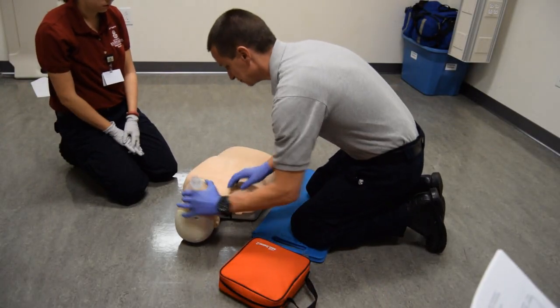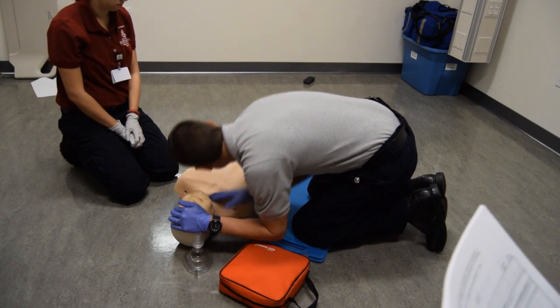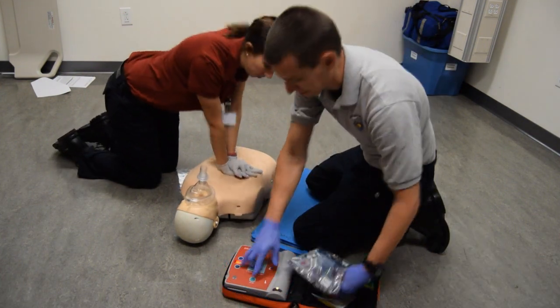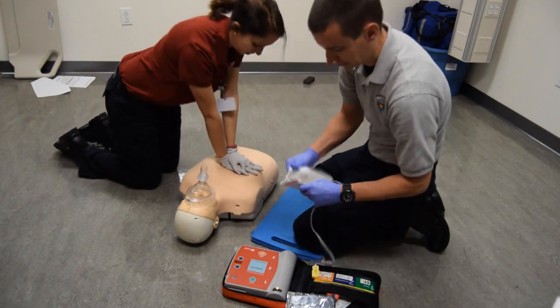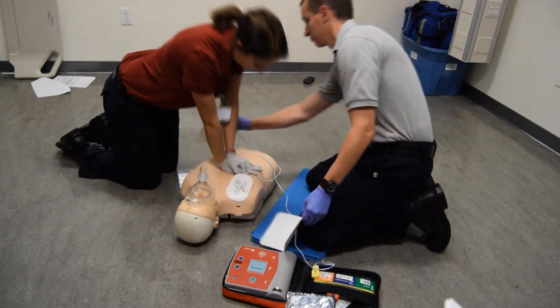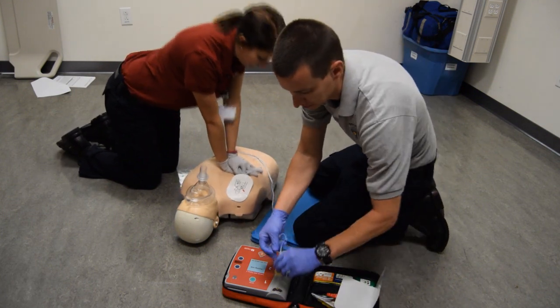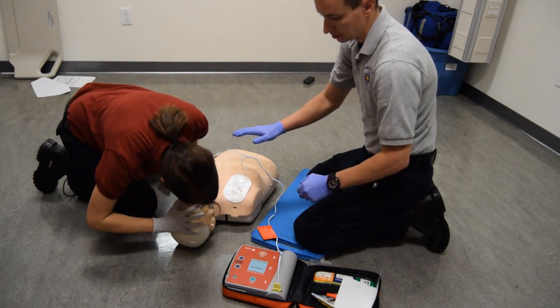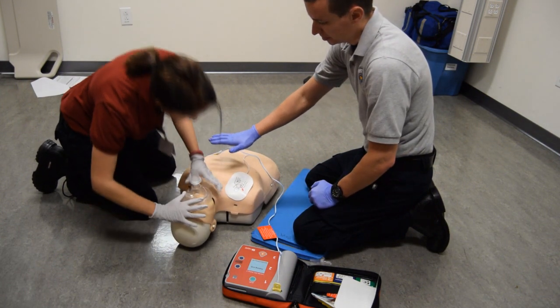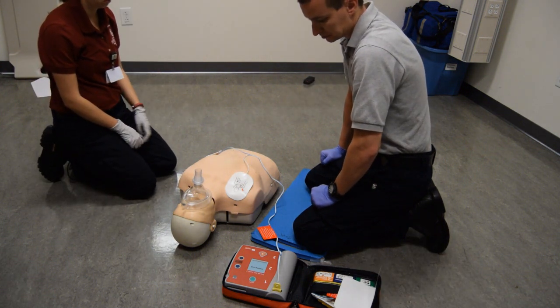After two minutes of CPR, the patient is assessed and the second rescuer resumes compressions while the candidate operates the AED. Start CPR — make sure you're doing good, high quality CPR, please. The candidate turns on the power to the AED. Apply pads to patient's bare chest. The candidate follows the prompts and correctly attaches the AED to the patient.